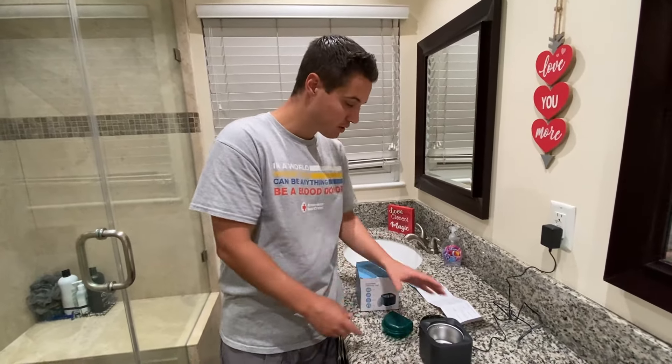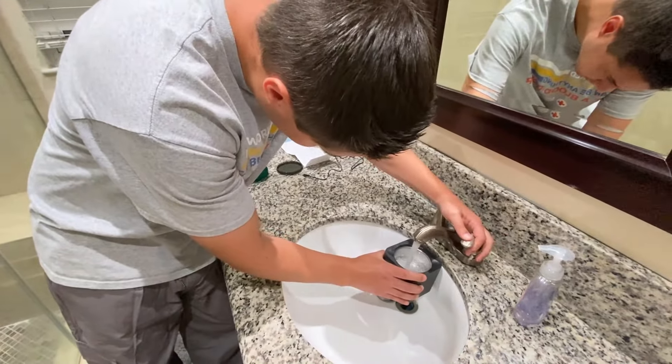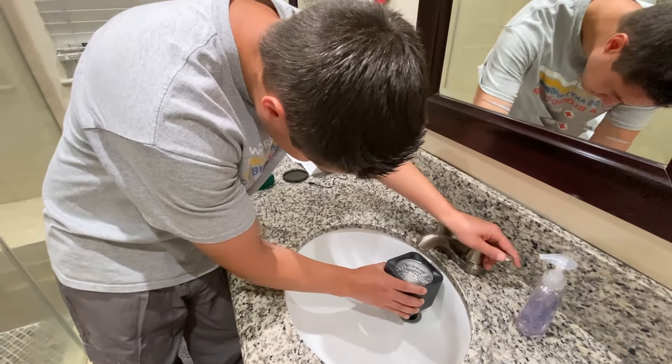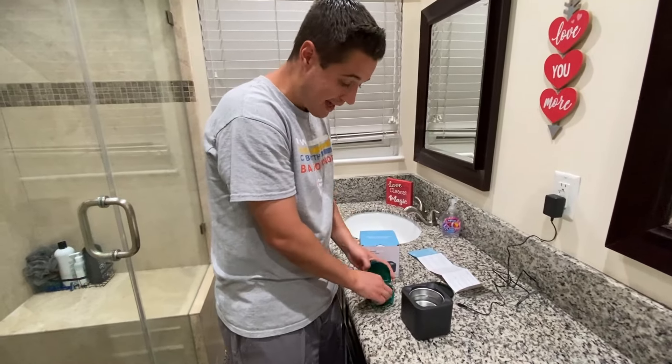Basically what you do is you fill up water to this max fill line. You don't want to go above the max fill — you don't have to go exactly to it, but you don't want to go past it.